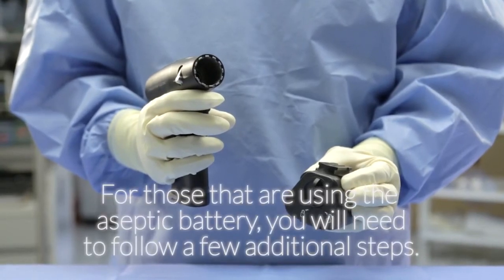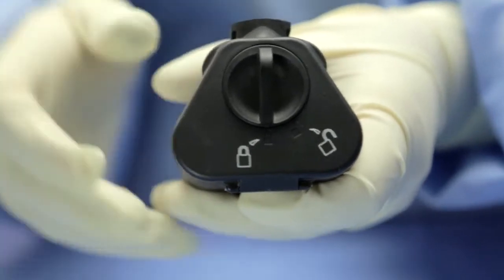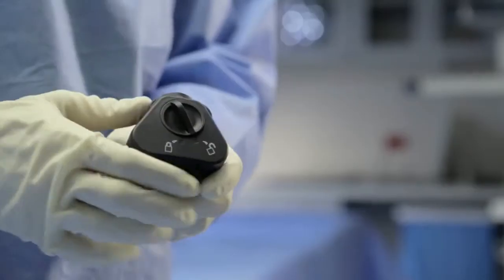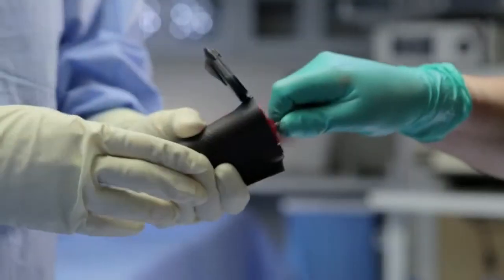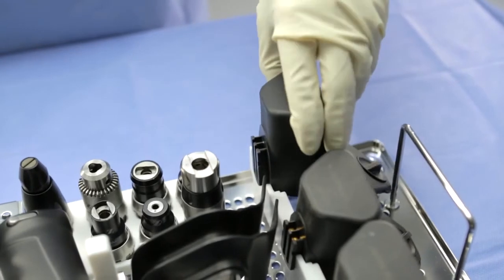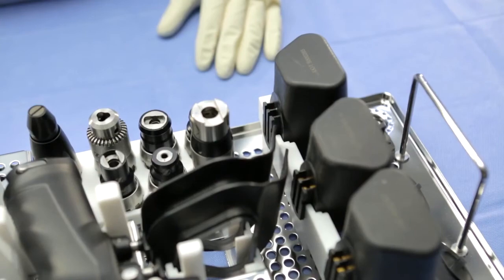For those using the aseptic battery, you will need to follow a few additional steps. After the battery housing has been removed from the handpiece, turn the battery housing locking mechanism to the unlocked position. Open the housing door and pull the battery toward you by grasping the wire hook. Place the battery in the appropriate receptacle for transport, cleaning, and charging. Place the housing into the appropriate slot in the lift-out tray, making sure that the door is in an open position.